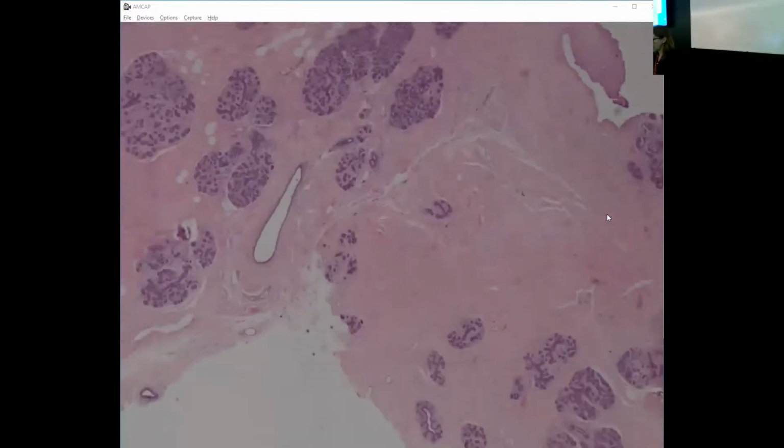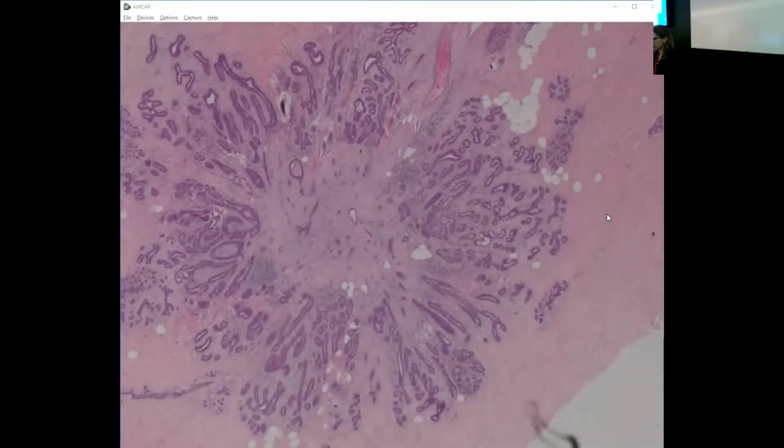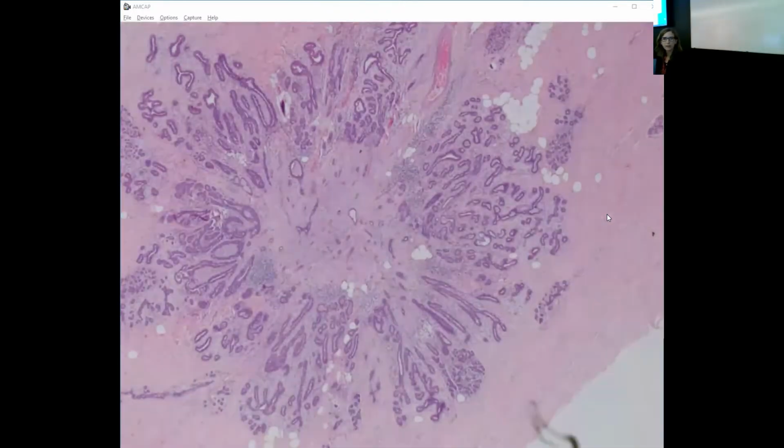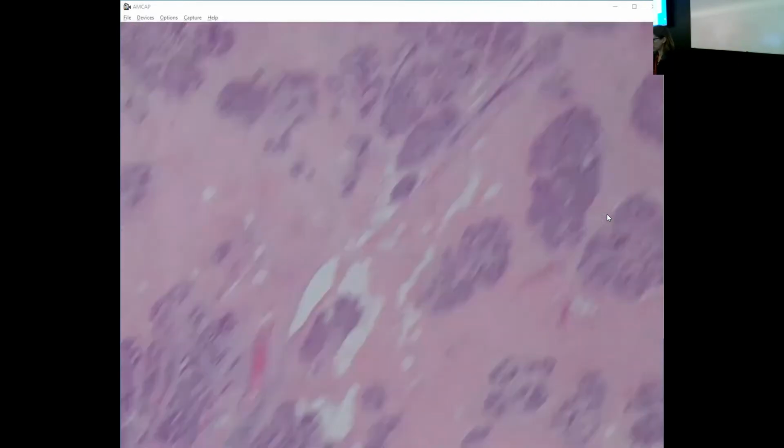So this one is just a beautiful contrast with that, where we see such a lovely example of a radial scar. And I think, oops, hang on. Is that better? Where we can see the, we have the whole, I think it's, no, it's an excision.